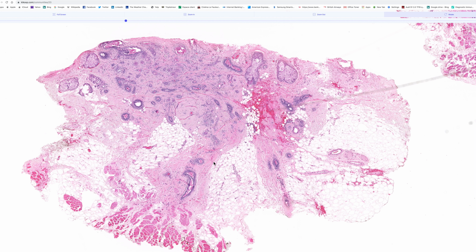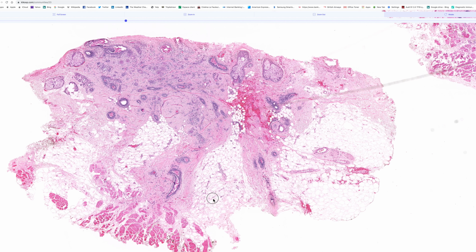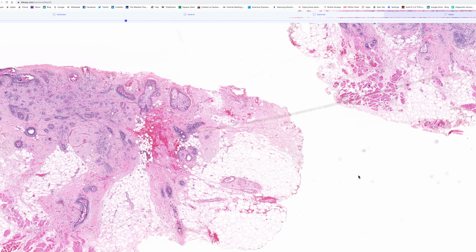And in a case like this, I would examine levels and process the rest of the tissue if there's anything left in the specimen container, and look further. It's also quite useful to do an S100 protein because obviously that highlights the nerves, and sometimes it makes it much easier to pick up the perineural infiltration.